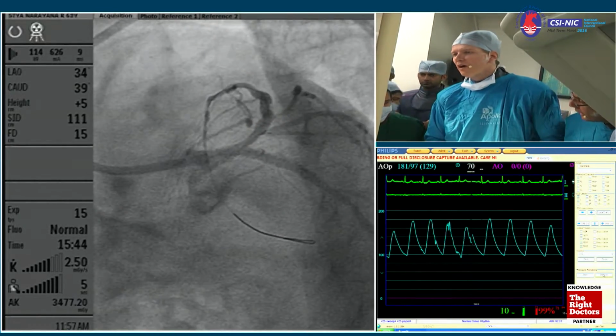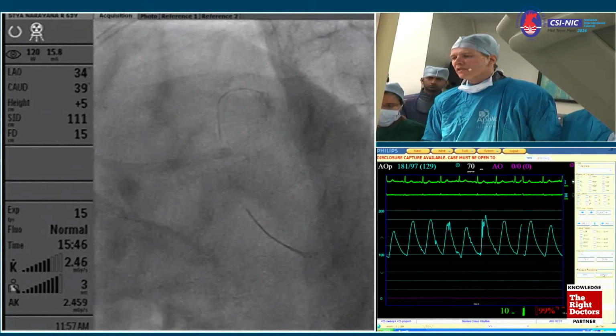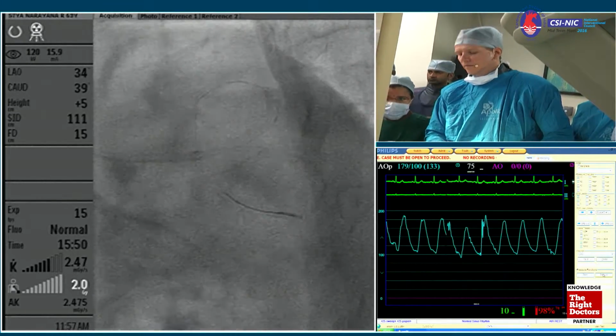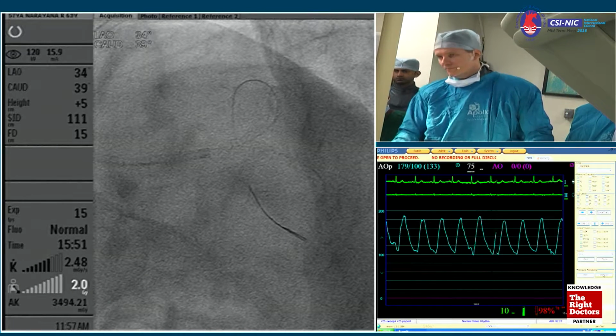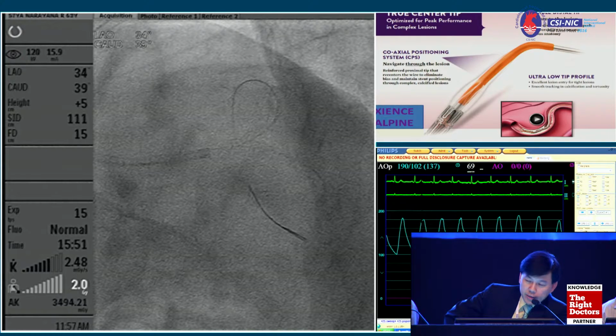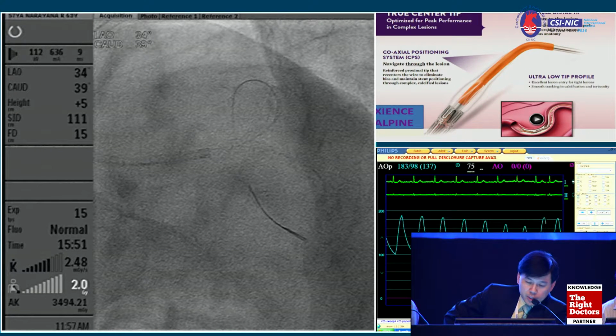LAD where? Let me see, I check that. Hi, Christoph, this is Hui Chim here again. I am just feeling here that with or without the IVUS right now, it is going to be hard to leave the ostium of the LAD alone. If you look at the LAD, the ostium is much smaller than the distal diameter. And now that you have balloon angioplasty, some kind of trauma may have already occurred at the ostium of the LAD, and this may be a spot for restenosis, which is a bad spot. So I would err on the side of caution and just go ahead with a stent.